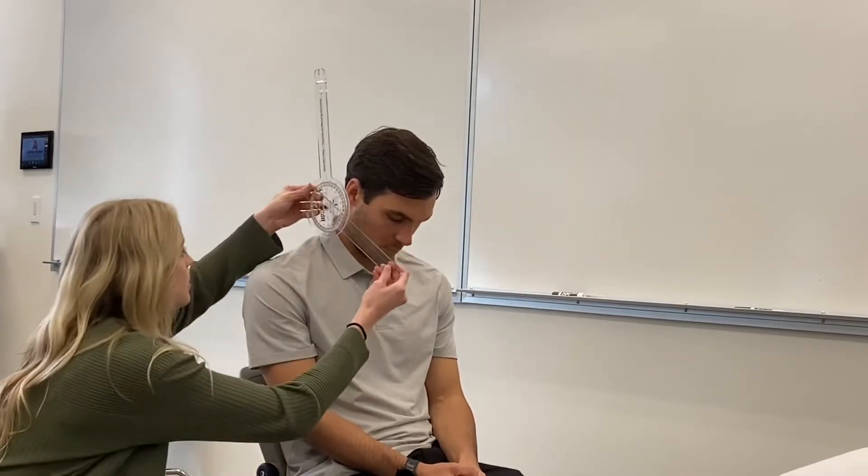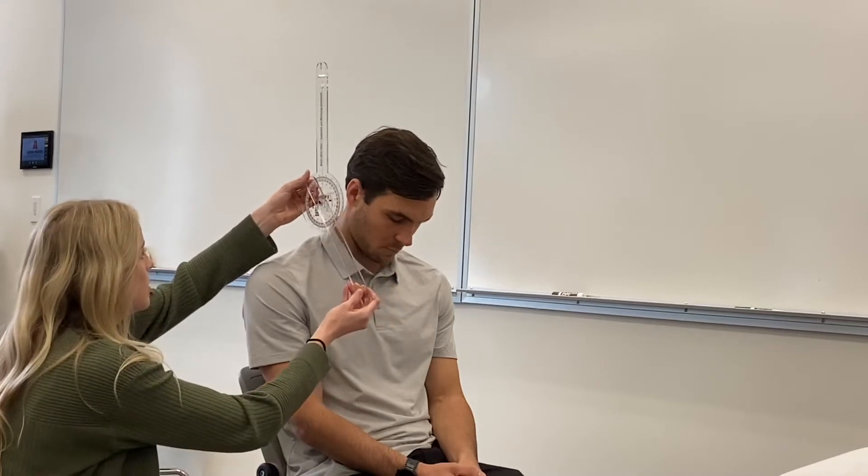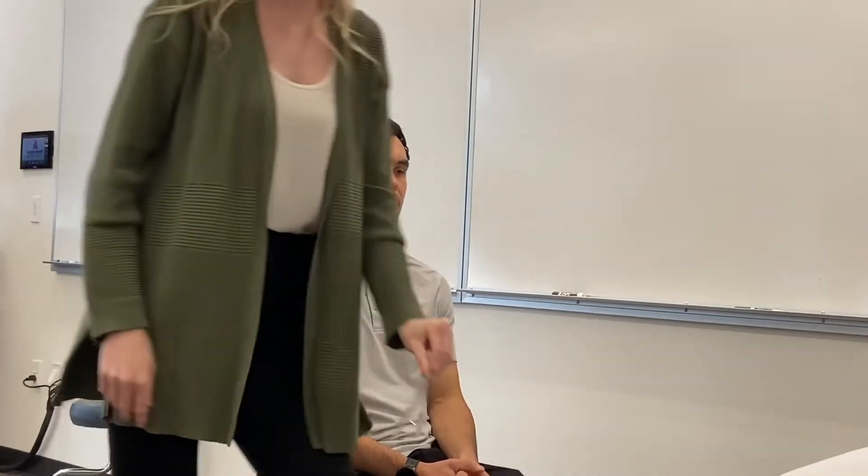For flexion, you're going to have the patient go all the way down towards the floor, keeping their trunk in neutral. So if he gets to 55 degrees, normal is going to be 45 to 50.